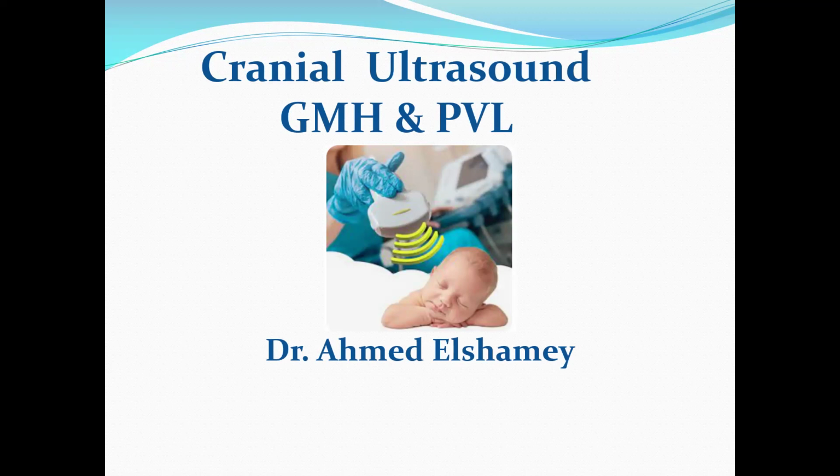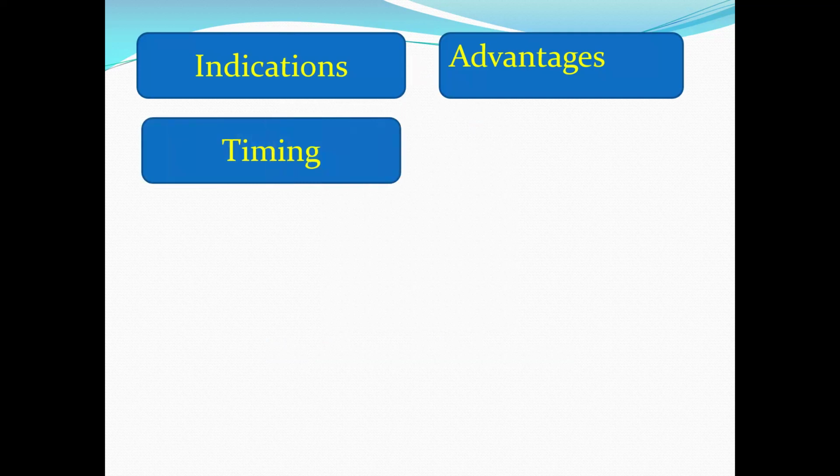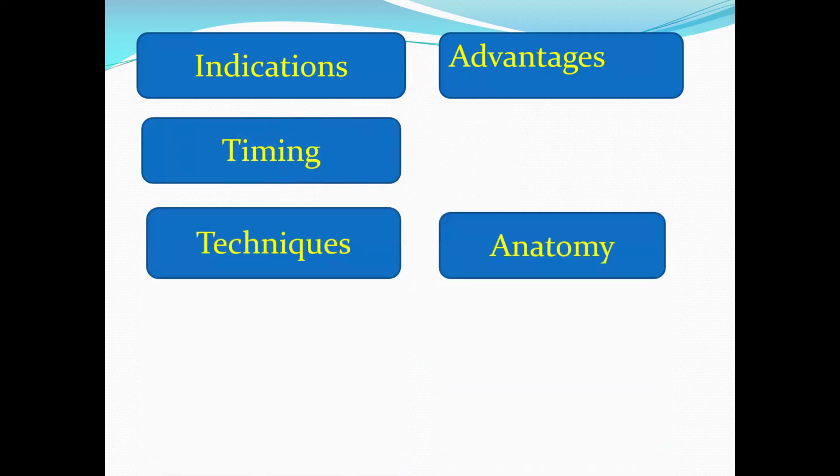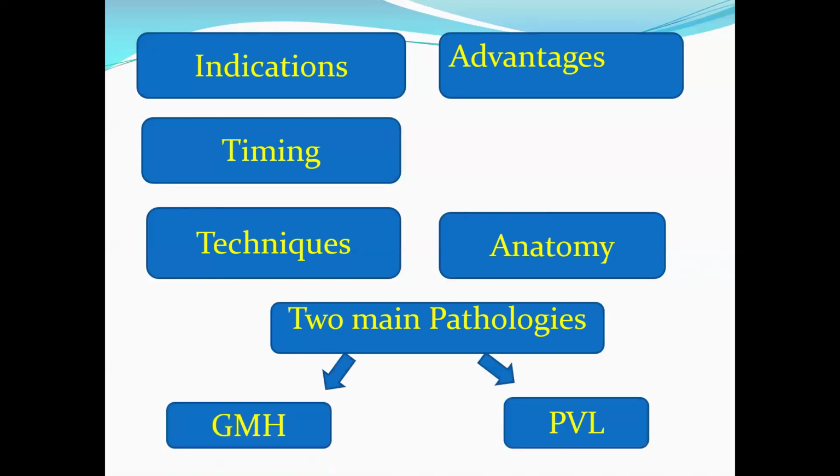I will give a short brief about cranial ultrasound. First, I will talk about indication and advantage, timing of full ultrasound, techniques and anatomy, and two main pathologies, as I said, germinal matrix hemorrhage and PVL.